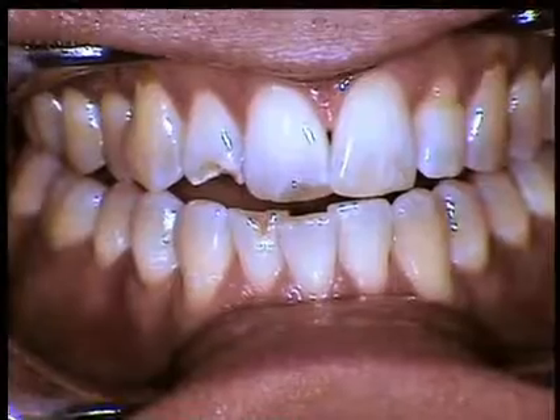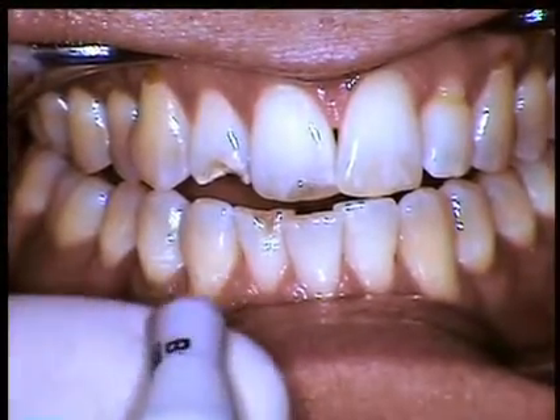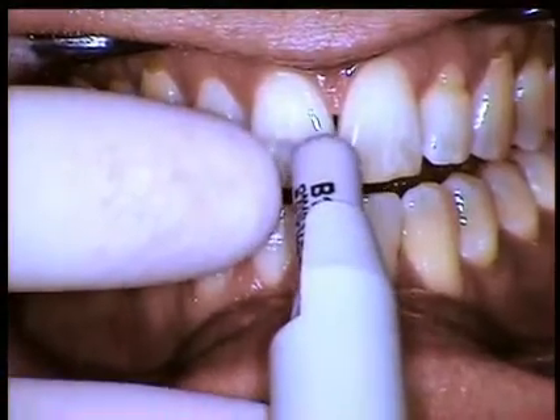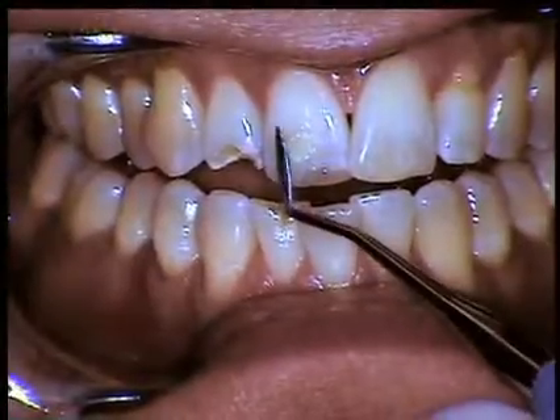Before we dehydrate the tooth or start any process, I like to express a little bit of the selected color — the body shade, approximately B1 — directly out onto the tooth. I'm not going to bond or cure it; I'll just thin it out a little to get an idea if we're going to be in the right shade or family.